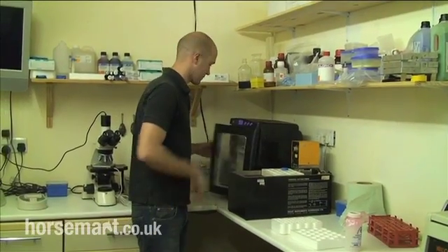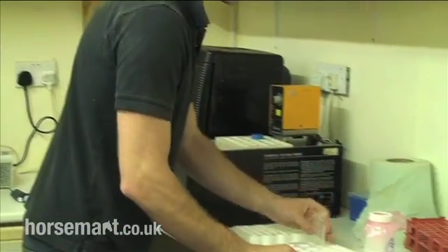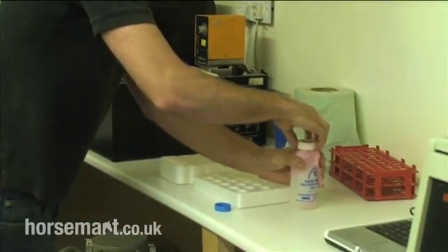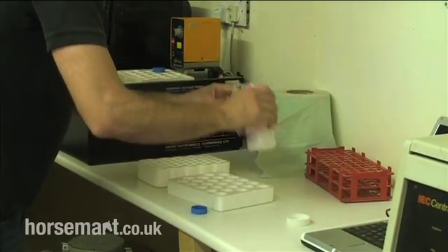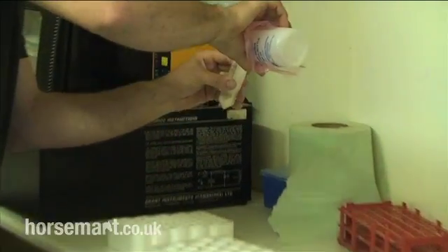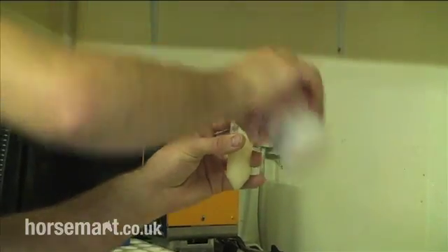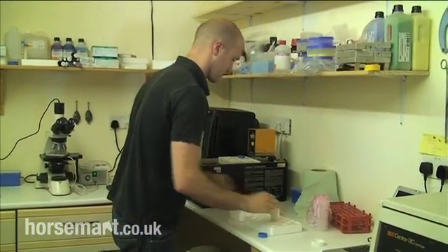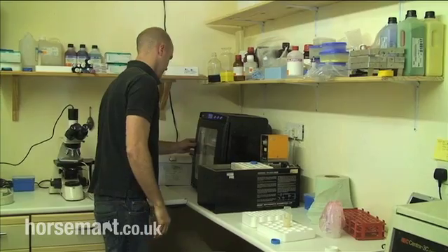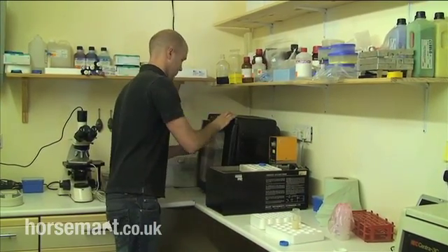Semen when it comes into the lab has to be counted. You have to count how many sperm are actually in the ejaculate — the concentration. You determine the volume, which is what Jamie is about to do now. He's got a 50 ml centrifuge tube. He's pouring the semen into it, and in a moment he'll hold it up to determine the approximate volume. He'll multiply that by the volume to determine the total number of sperm in the ejaculate. It looks like a reasonably concentrated sample.